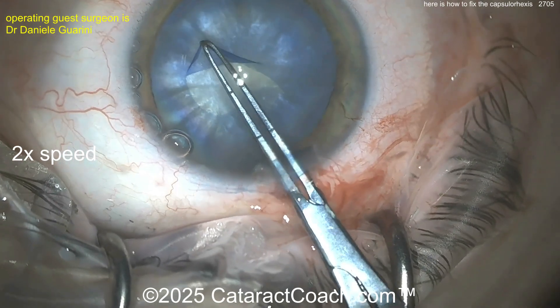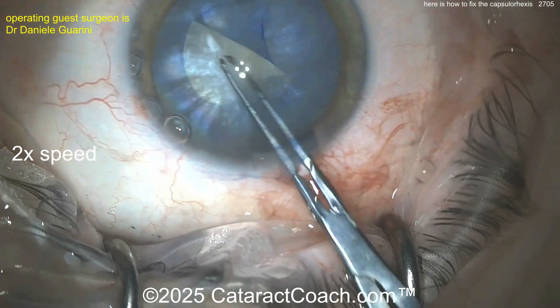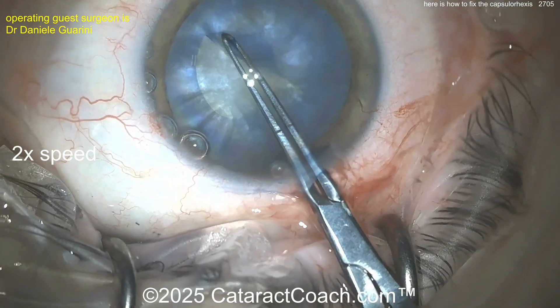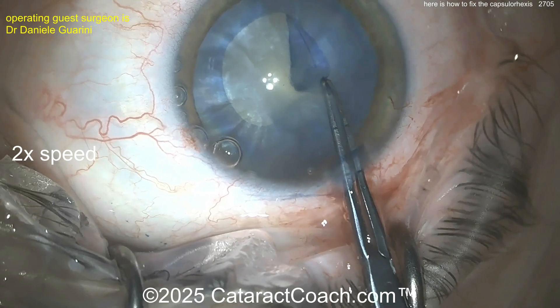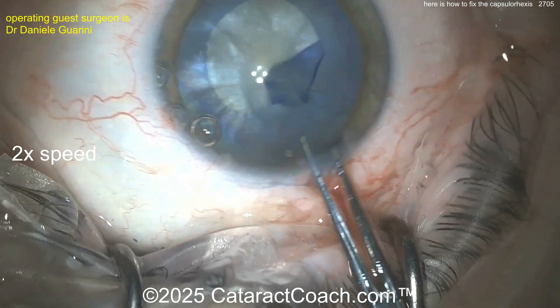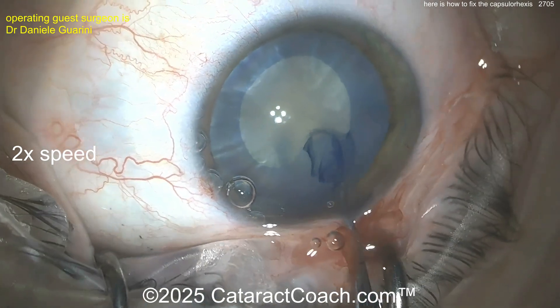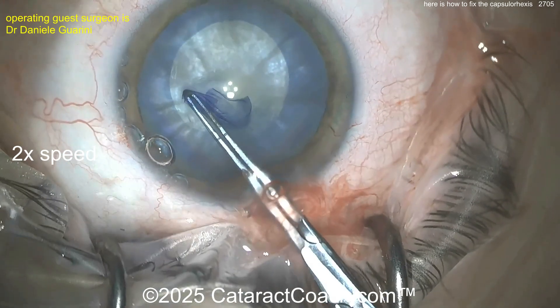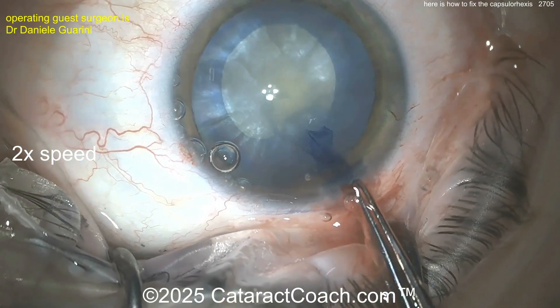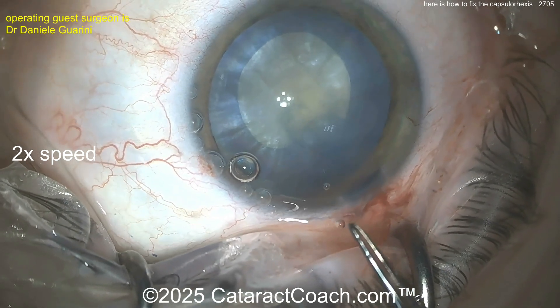Here comes the rhexis. Now your forceps do have marks at two and a half and five millimeters — you can use those to help measure. That looks like a pretty good sized rhexis. Keep it going. Pretty good, I like that. Good rhexis. Keep it going. Keep it big though — you're coming in a little bit. No, no, no — see? You got a little bit afraid. And now look what do you got? Started off okay, but then you made it too small and now it's decentered.